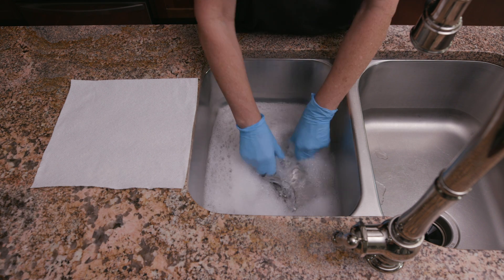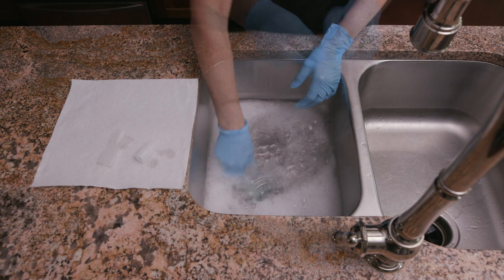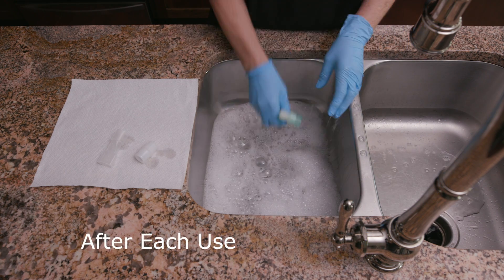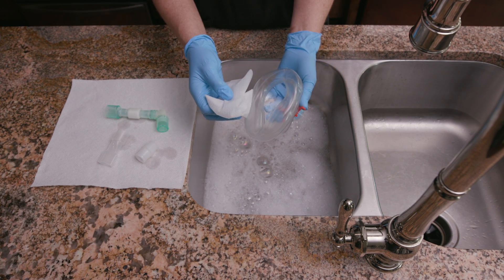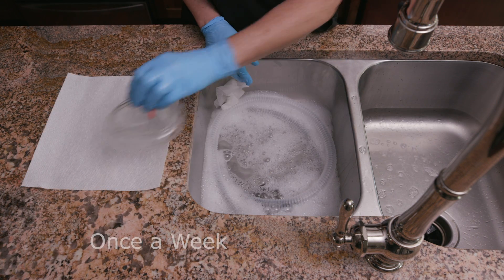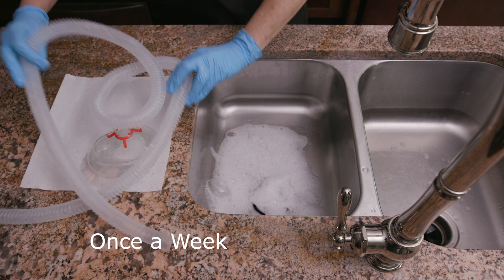Regularly clean cough assist tubing, mouthpieces, masks, and trach adapters to prevent respiratory infection. Wash the mouthpiece or trach adapter in warm water and standard dish soap after each use, then rinse with warm water and air dry. Once a week, wash the mask and tubing in warm water and standard dish soap, then rinse with warm water and air dry.